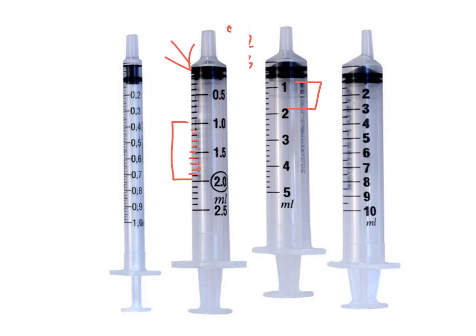Whereas the other one, looking at this syringe, since it's a lot closer together, everything has to be evenly spaced. I couldn't count that as 0.1, 0.2, 0.3, 0.4 because this next line that's counted off for us would have to be 1.5, and it's not. So, therefore, we count off in 2s instead. In this case, that's where we count off 1.2, 1.4, 1.6, 1.8. And then between the 3 and the 4, this will be 3.2, 3.4, 3.6, 3.8, and so on and so forth.